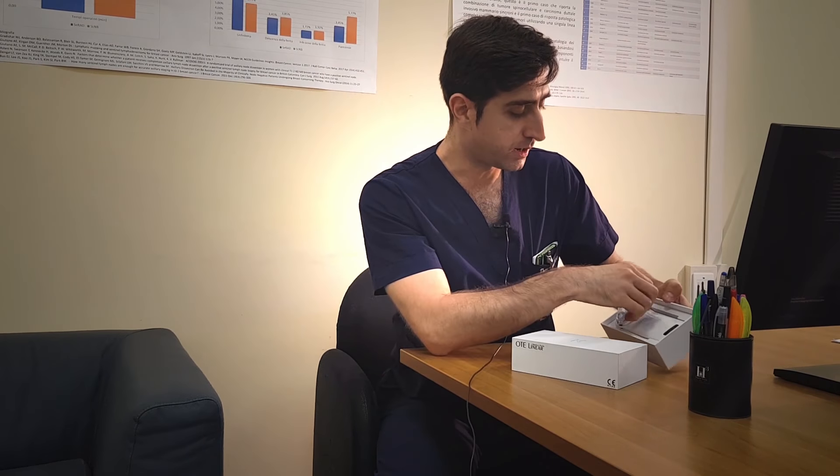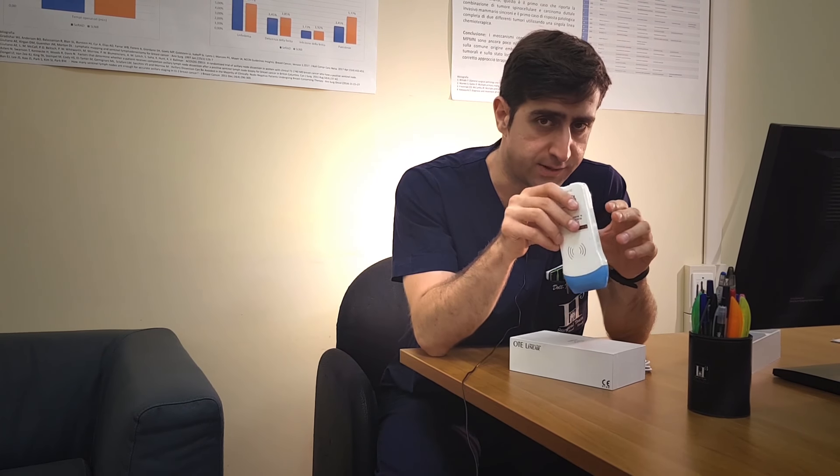This is a portable ecograph. It has a linear probe that goes from 7 to 10 MHz, which we use both in the laboratory and in the department for the senological field. With this ecograph we complete the senological visit, exploring in more detail the neoformations that we can feel by palpation, or finding even the neoformations we cannot palpate, where we can then place a dermographic marker on the cutaneous projection of the nodule.